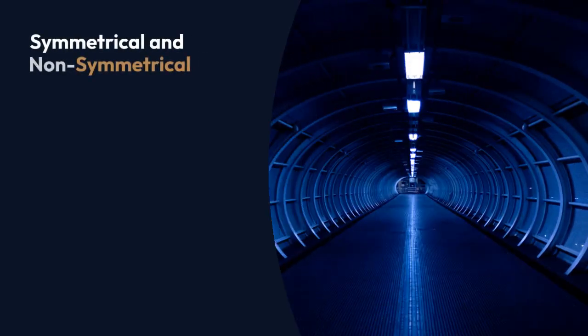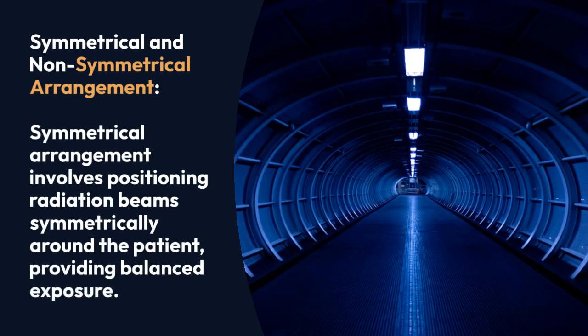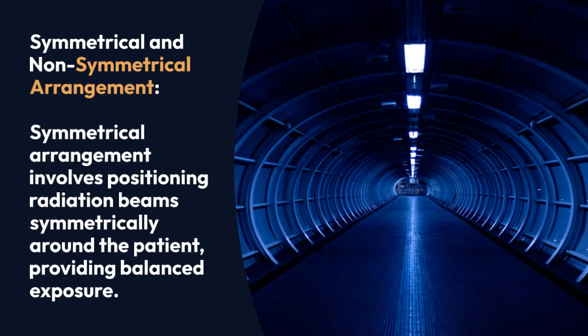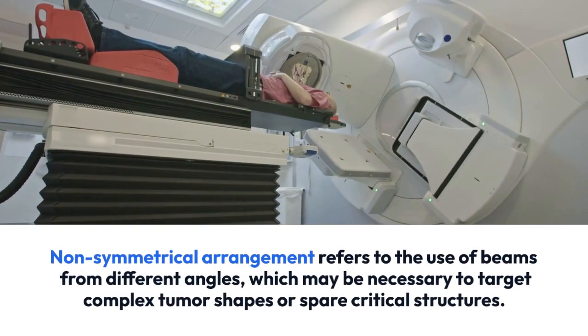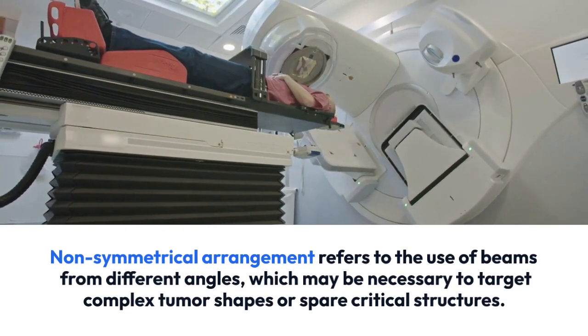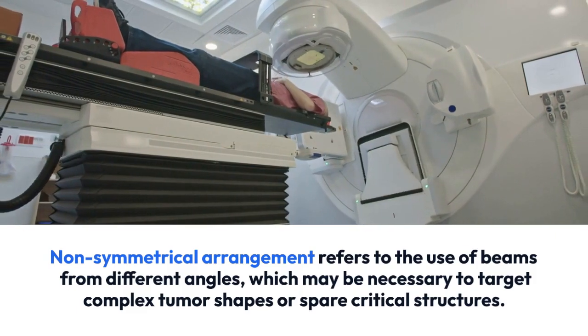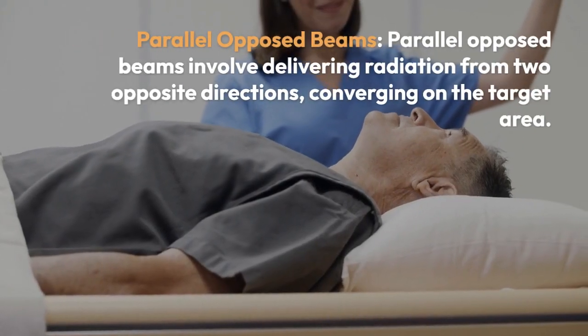Symmetrical and non-symmetrical arrangement. Symmetrical arrangement involves positioning radiation beams symmetrically around the patient, providing balanced exposure. Non-symmetrical arrangement refers to the use of beams from different angles which may be necessary to target complex tumor shapes or spare critical structures.